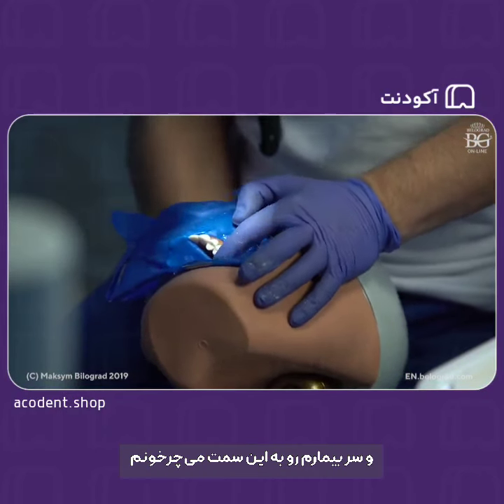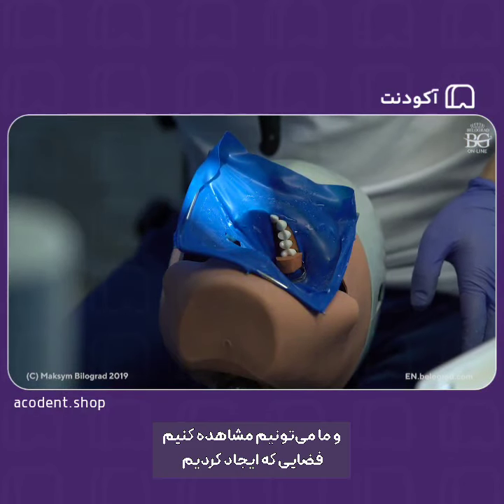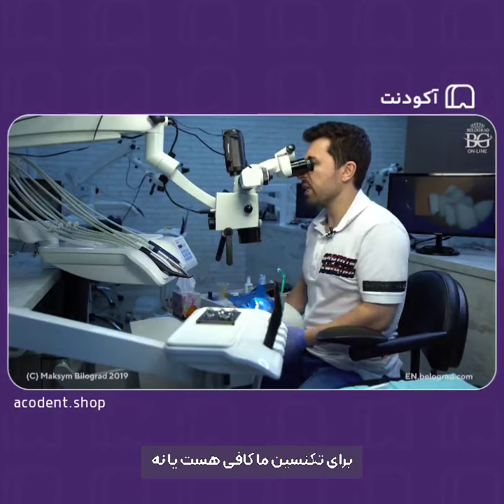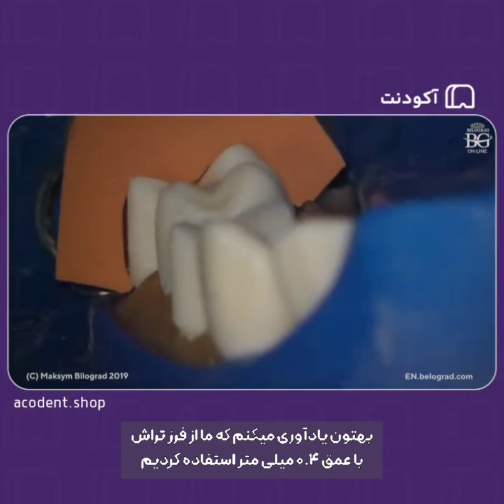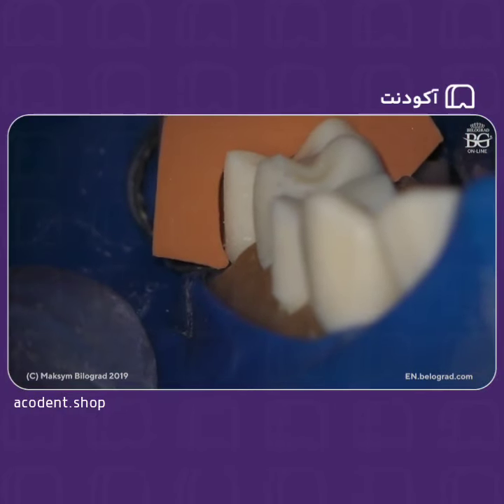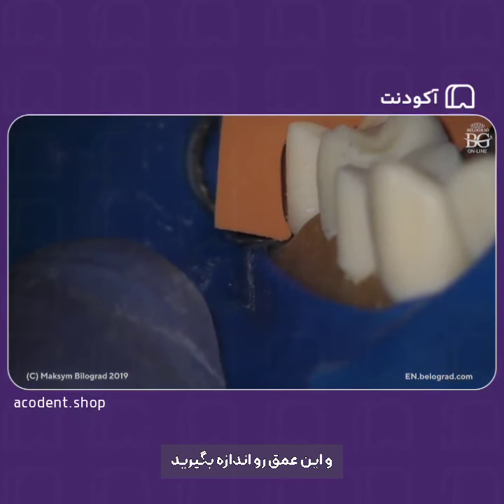Okay, I turn the head of my patient this way, and we will be able to observe if the space that we create is enough for our dental technician. I would like to remind you that we used the depth cutting burr 0.4. So you can take a periodontal probe and measure.